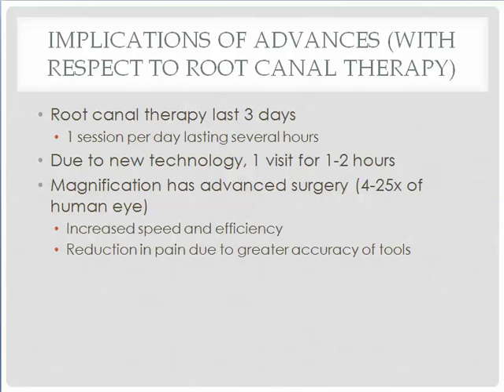Due to advances in visual aids, root canals have gone from being a 3-day procedure to a 1-day, 1 to 2 hour visit. This can be attributed primarily to tools that allow magnification 4 to 25 times the human eye. This has resulted in increased speed and efficiency of the endodontist in respect to more precise motions with less errors. In addition, the patient benefits from a reduction in pain.